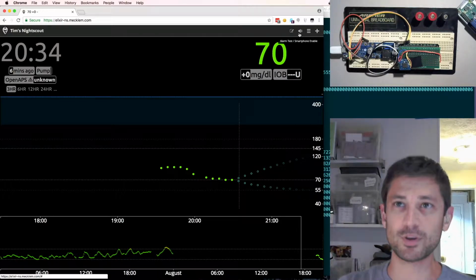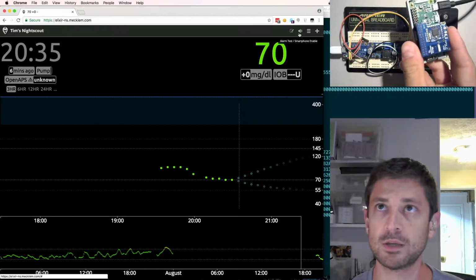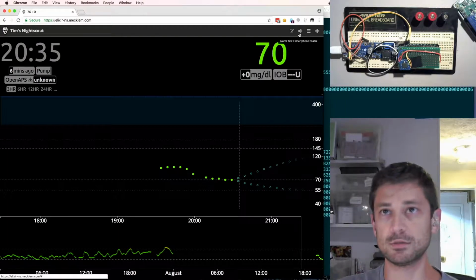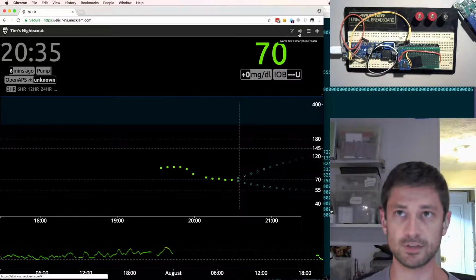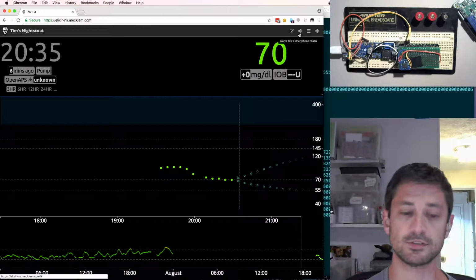It's attached to my body, and that's a little bit embarrassing, so I'm not going to do that. But one of the problems that I'm having is when this tiny computer here boots up, the first thing it tries to do is connect to a wireless internet connection and then grab the local time. So it wants to get very precise time data via NTP. That all runs inside Nerves, inside the Elixir app. It goes and finds an NTP date and then sets the system time.